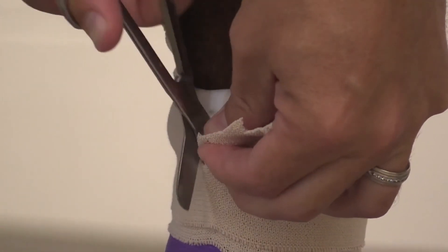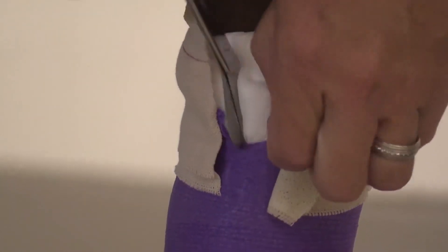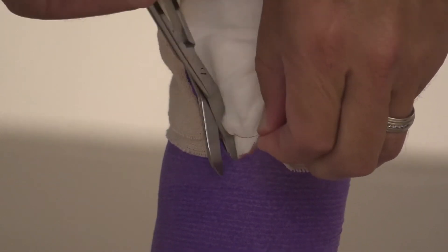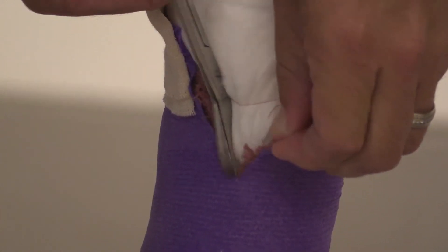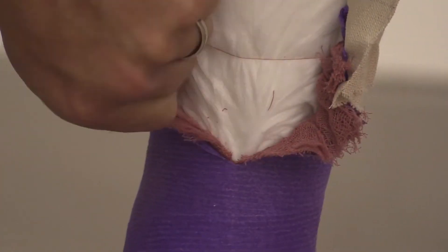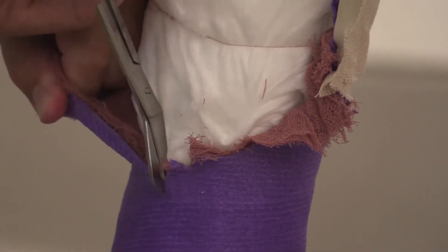We'll use bandage scissors to remove the bandage. We will cut off the Elasticon and then get the bandage scissors up underneath the vet wrap and brown gauze — you can see it's still fairly snug at this point. A lot of times when you're removing it, the bandage material is already a little looser, as it doesn't completely stay tight beyond two to three days — that's why it has to be replaced. The biggest thing is to make sure you're not cutting next to the skin. Bandage scissors have a blunted tip on the inside that keeps you from poking or penetrating the skin, which is very important when removing a bandage.